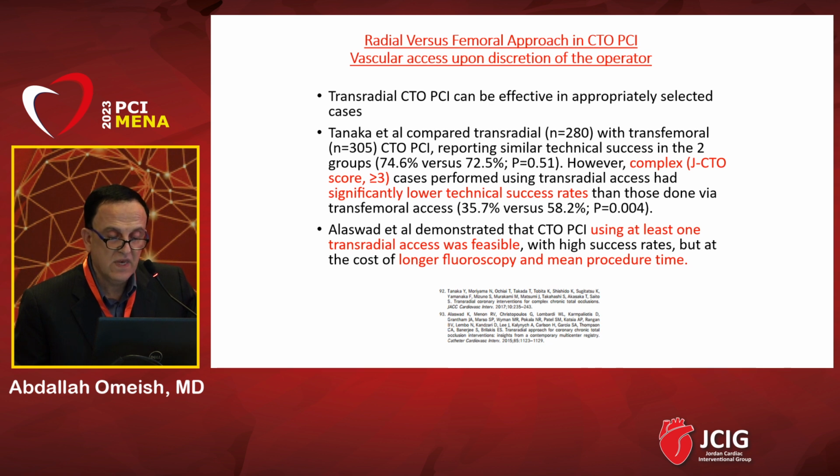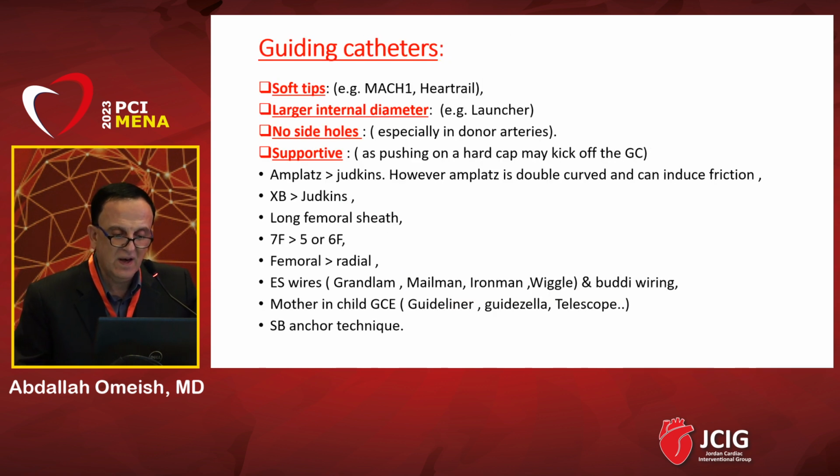Never compromise on safety, this is very important. Several knowledge gaps are present in CTO PCI, and from my own experience, the results are not as reproducible as in structural heart interventions. Regarding the radial versus femoral approach in CTO PCI, the vascular access is at the discretion of the operator.